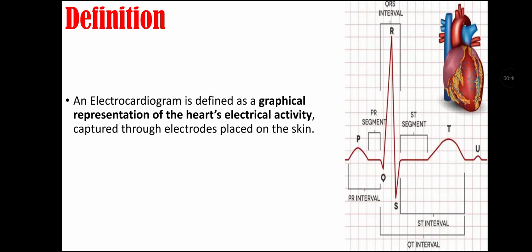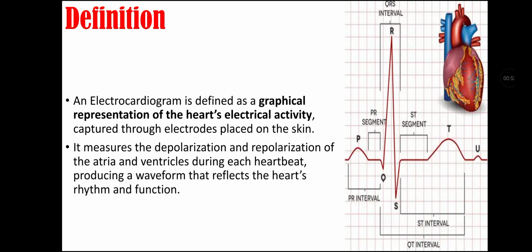Definition: ECG or electrocardiogram is defined as a graphical representation of the heart's electrical activity that is captured through electrodes placed on the skin. It measures the depolarization and repolarization of atria and ventricles during each heartbeat, producing a waveform that reflects the heart rhythm and function.